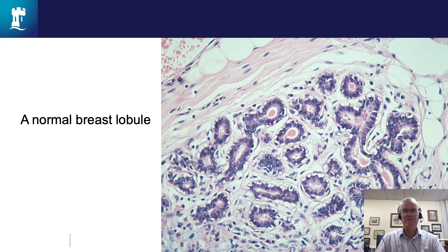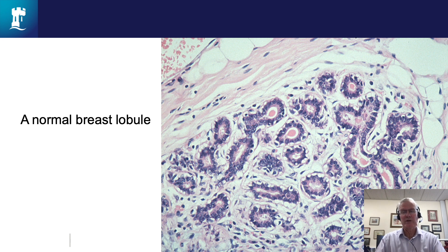Breast cancer arises from the lobular and ductal luminal epithelial cells — those are the dark purple circles. A well differentiated tumour will mimic the appearance of those cells, whereas an undifferentiated or poorly differentiated tumour will have no resemblance to the normal structure. What grading tries to do is put a quantitative figure on how closely an individual patient's breast cancer resembles the normal lobule — that is, how differentiated it is.